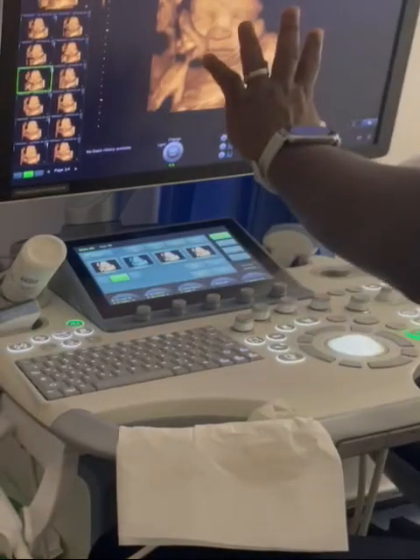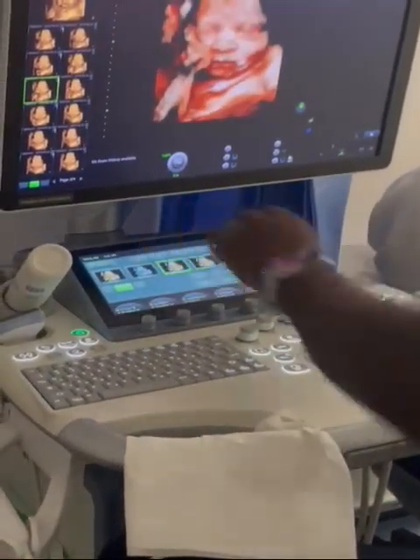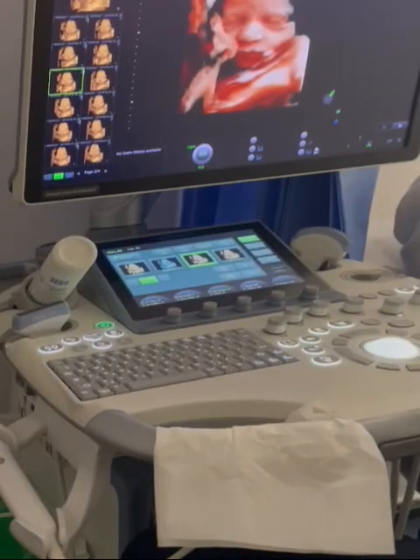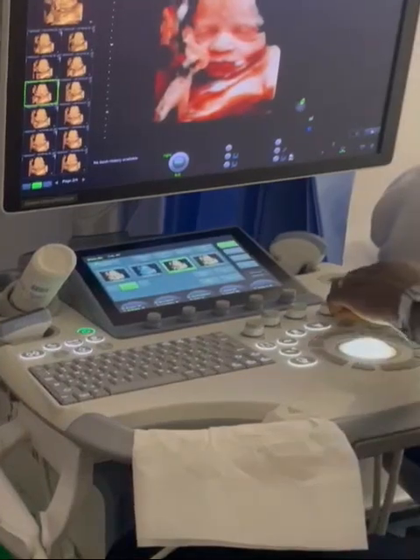So if I want to change to HD, which I promised to do, just press the HD key. It depends on which machine you are using. And so that's baby in HD. So it's closer. The skin color is closer. In this, I'm going to give you some of this free.